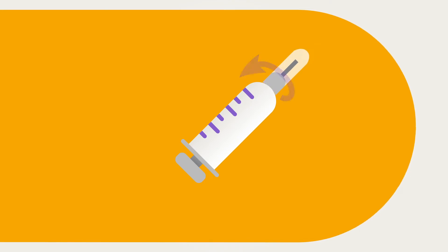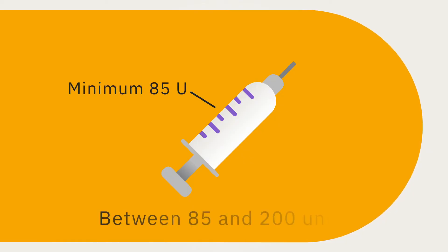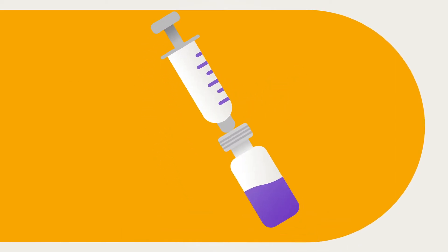Assemble the syringe by twisting the needle onto the syringe and carefully remove the protective cap. Draw air into the fill syringe equal to the amount of insulin to fill the pod. The pod must be filled with a minimum of 85 units and has a maximum of 200 units.